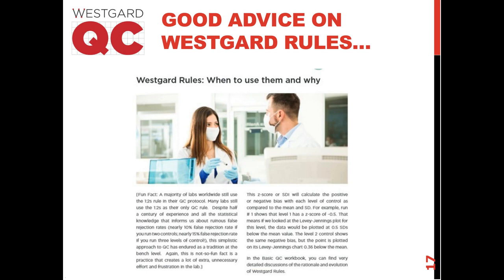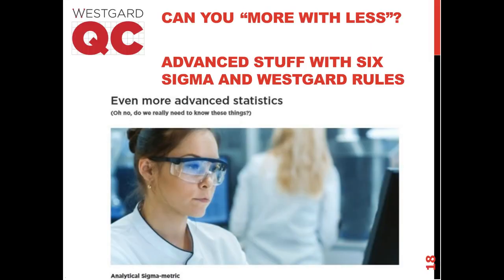That's going to bring us to the next stage where we talk about Six Sigma and more advanced techniques. If we're willing to invest a little bit of time in learning Sigma metrics or Six Sigma benchmarking, we can figure out how to do our Westgard rules, when we need them, and how many of them we need.